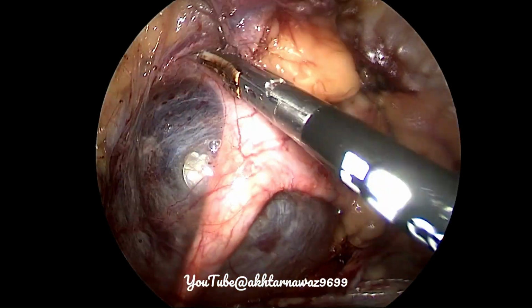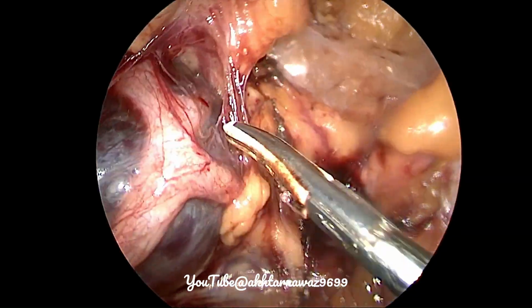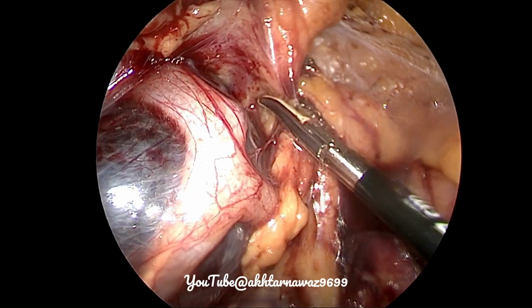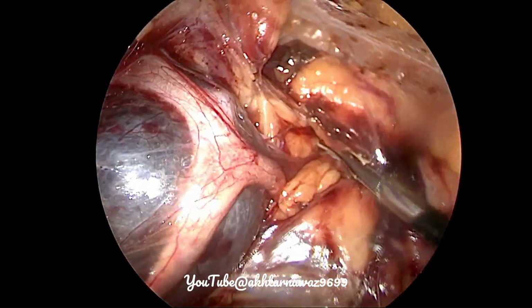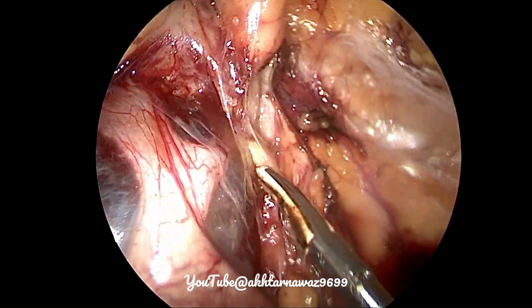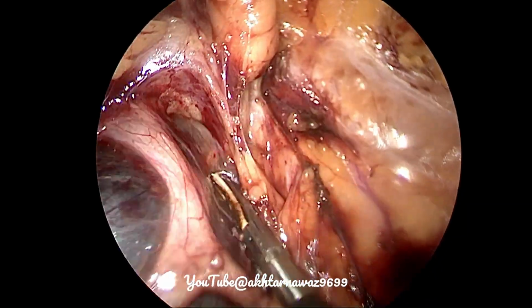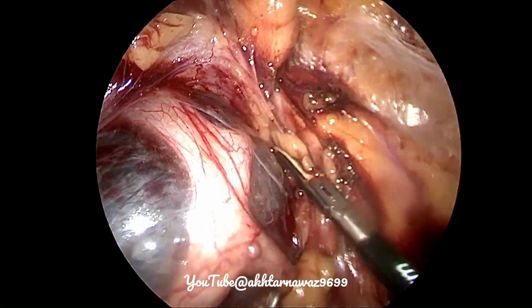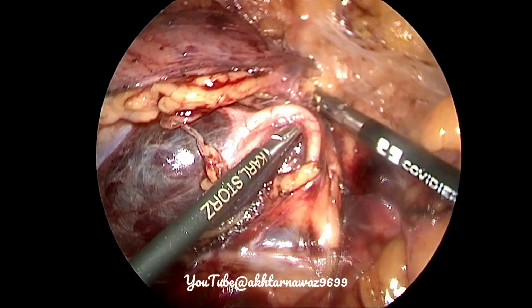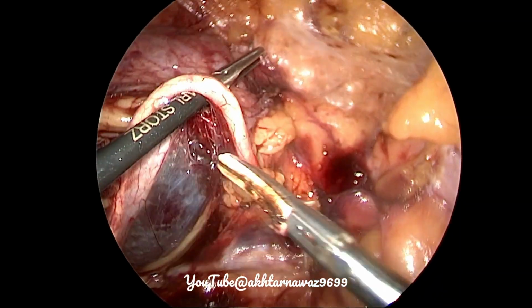So we dissect as much as we can, but there is no need for much dissection here, because the cyst is clearly visible, and its effect on the pelvic calyceal system is also visible. So our main aim is not to excise the cyst. We will just deroof the cyst so that the compression effect on the pelvic calyceal system is gone.